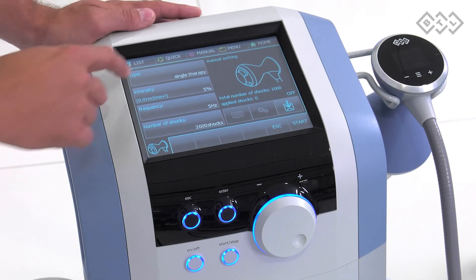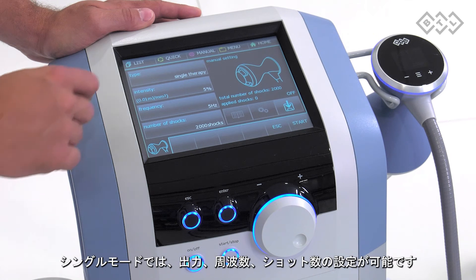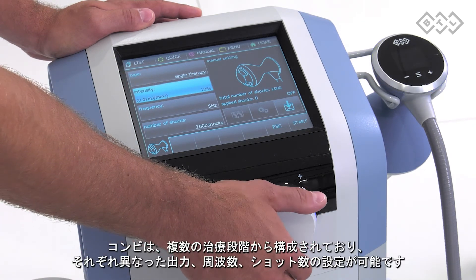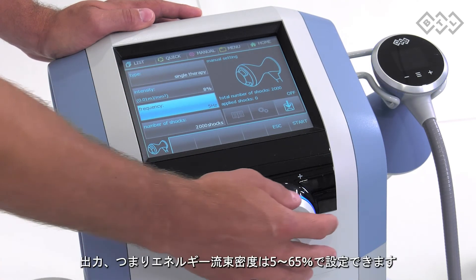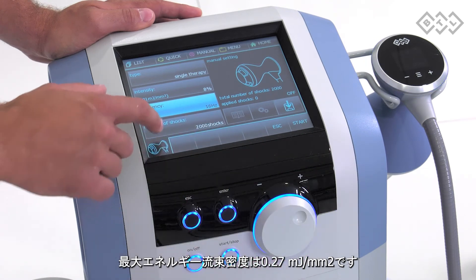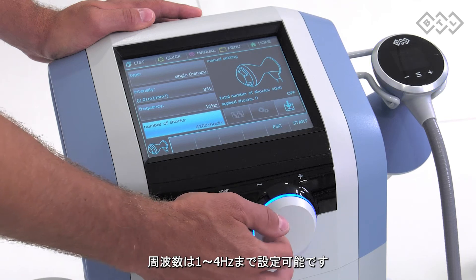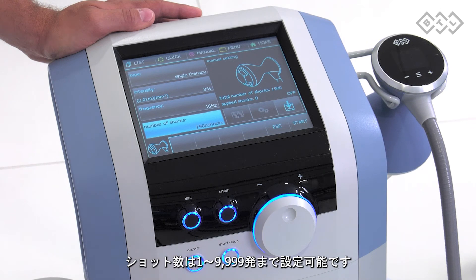Learn about therapy modes and settings. Two therapy types are available: single therapy or sequence. Single therapy allows setting intensity, frequency and number of shocks. The sequence consists of multiple parts which allow setting intensity, frequency and a number of shocks separately. Intensity — in other words energy flux density — is set in percentage within the range 5 to 100%; maximum value of energy flux density is 0.65 millijoules per millimetre squared. Frequency is settable within range of 1 to 25 hertz. Number of shocks is settable within range of 1 to 5000 shocks.